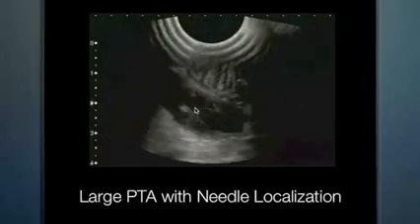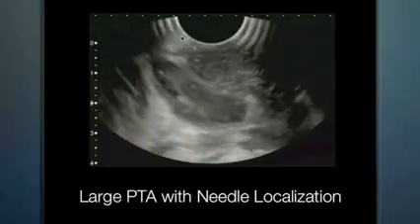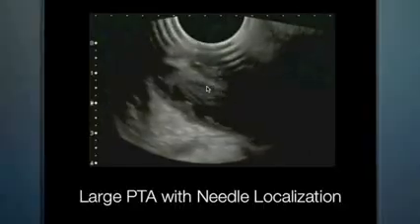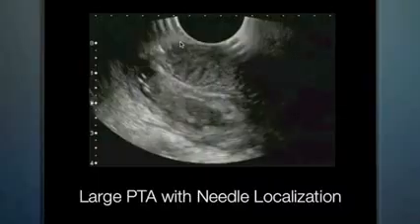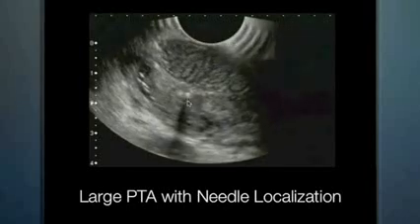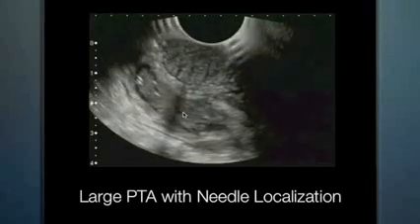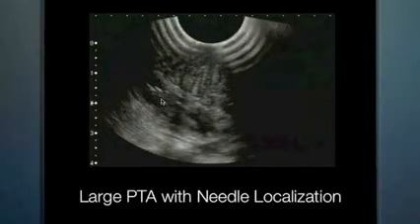And we can localize the needle. Here comes the needle as it's coming underneath the transducer. I like to have the needle come in underneath the long axis of the sound so I can see not just the needle tip, but also the needle shaft, which is not going on here. They're probably going under the short axis of the probe, and they instill some lidocaine. That's what that little blush was there, and a little more lidocaine, and then they will start to drain the contents out through the needle, and then the video clip ends.